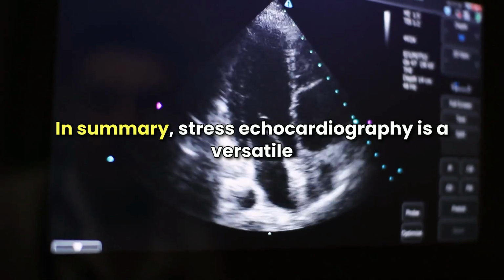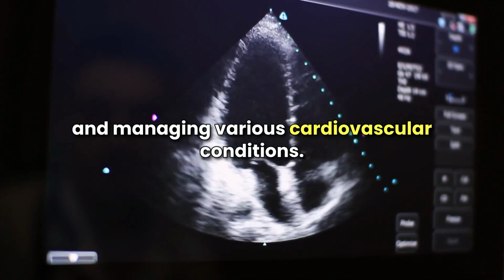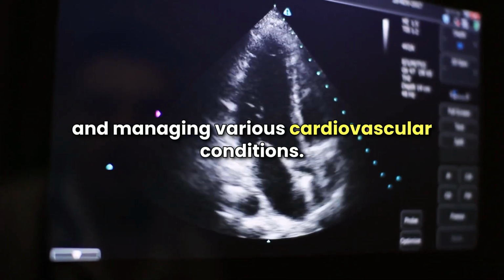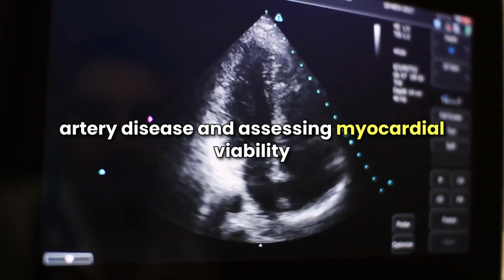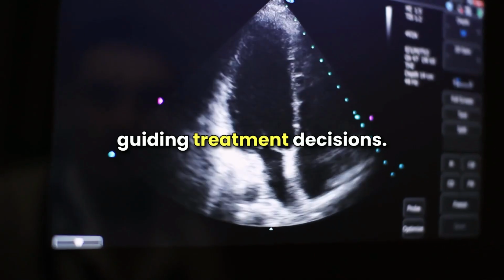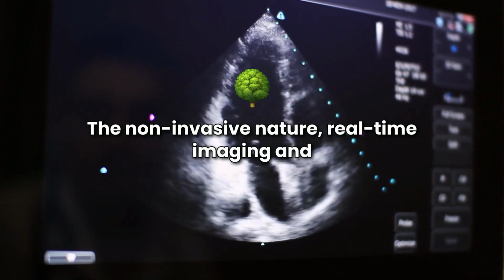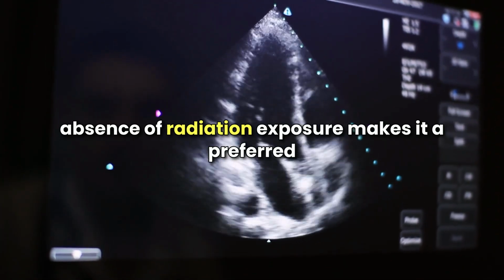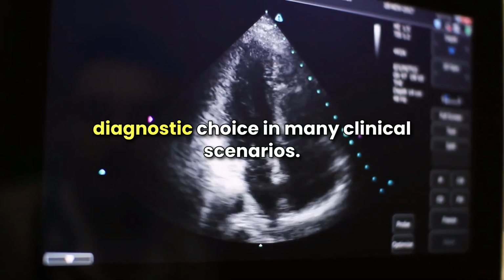In summary, stress echocardiography is a versatile and essential tool in diagnosing, assessing risk, and managing various cardiovascular conditions. Its applications range from detecting coronary artery disease and assessing myocardial viability to evaluating valvular heart disease and guiding treatment decisions. The non-invasive nature, real-time imaging, and absence of radiation exposure make it a preferred diagnostic choice in many clinical scenarios.